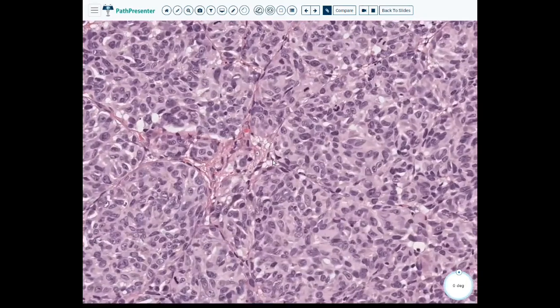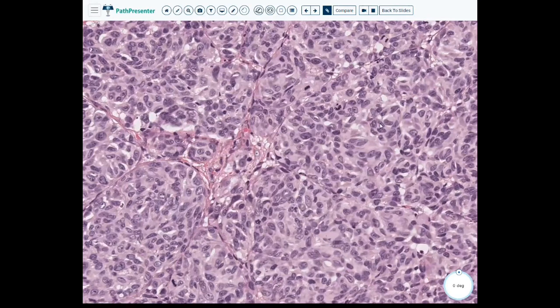All right, we have these nodular nests of somewhat pleomorphic melanocytes. We have some very bizarre mitotic figures, right? Like this one looks like maybe a smiley face with a cycloptic eye, and this one almost looks like a butterfly or vertebral body. And then we also have normal looking mitotic figures, like that looks normal, this looks normal, this looks normal, but it's a lot of mitotic activity.